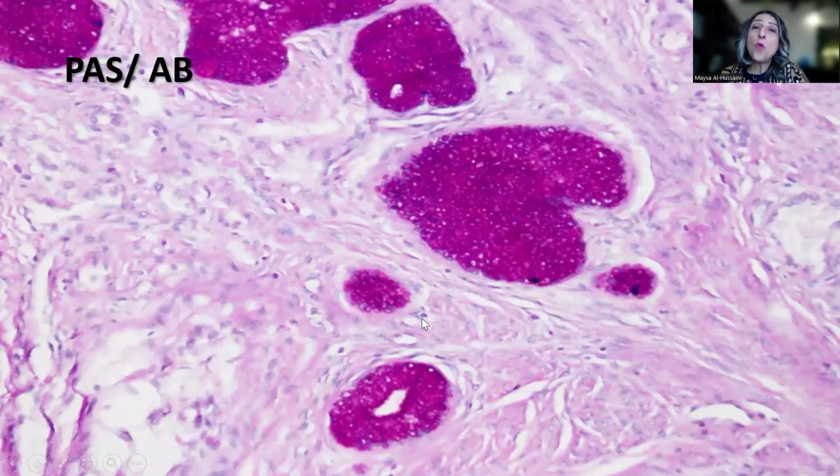Now, one important clue and very helpful stain to perform in order to support the diagnosis, at least that there is gastric-type differentiation, is the combined PAS Alcian blue stain, and the gastric-type carcinoma is usually positive with the PAS for neutral mucin. Why is that? Because gastric-type carcinoma shows pyloric-type differentiation, and these usually contain neutral mucin, and neutral mucin is usually positive with PAS.